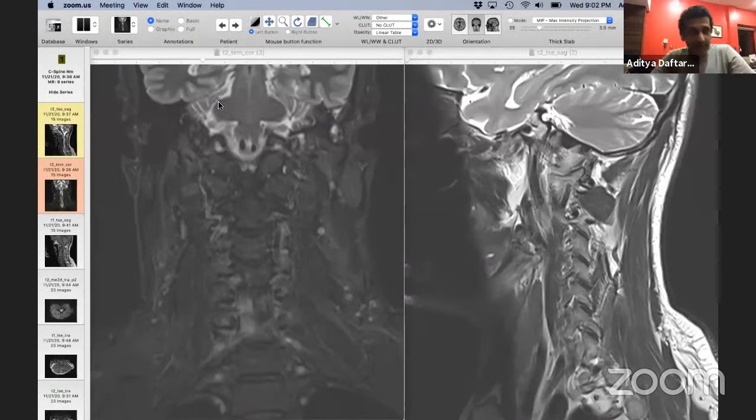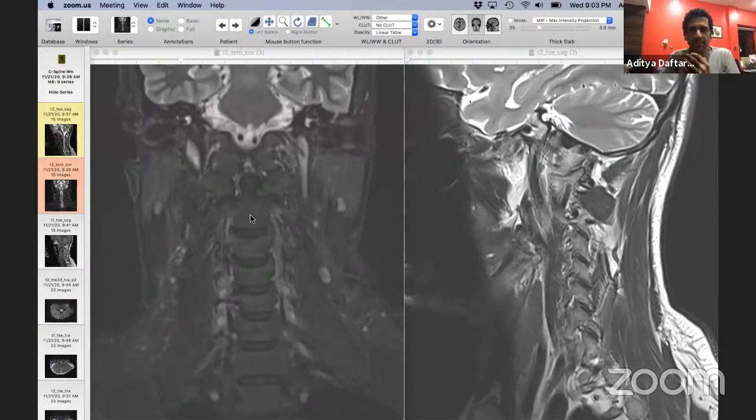It's good to be here. Like we said, radiology provides you an excuse for surgery. So I think it's important that you find the excuse as well. And that will be the purpose of this session, essentially. So I'm not going to waste much more time in this. I think one of the things that everybody always wants to know is some sort of an approach on how you can read the spine.